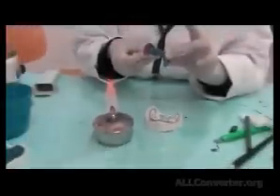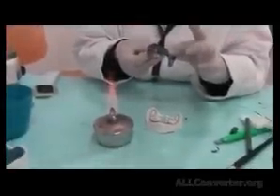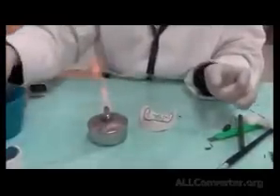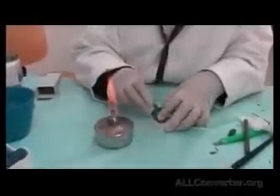Okay. So the material was deficient the first time. I added more material. Lower sulcus is a bit tricky sometimes because it is thin in comparison with the upper.